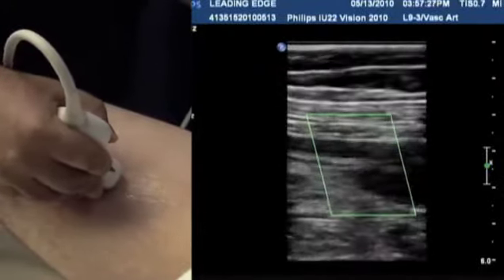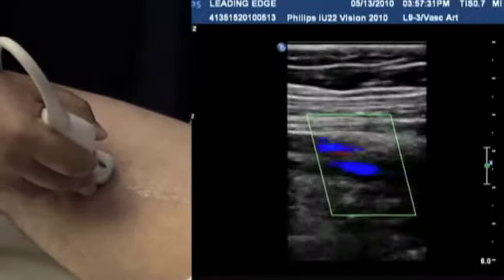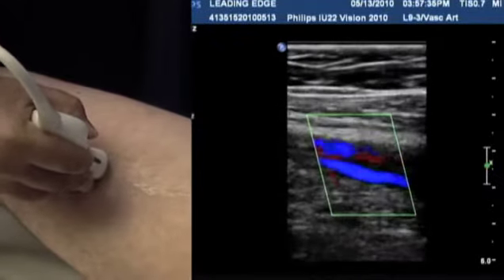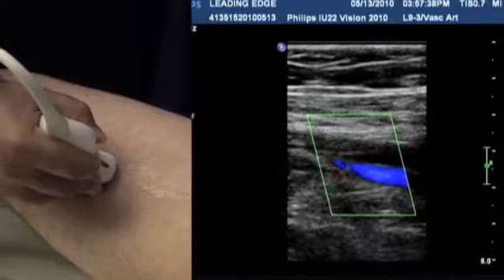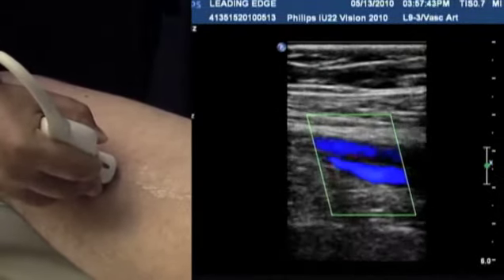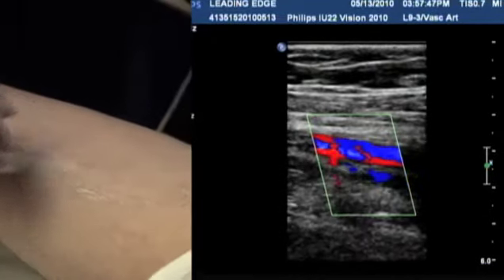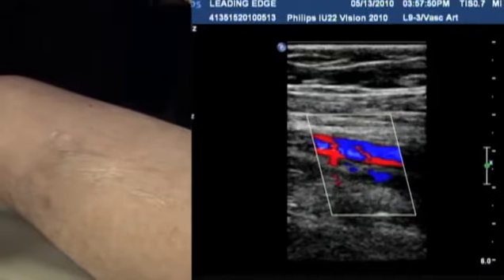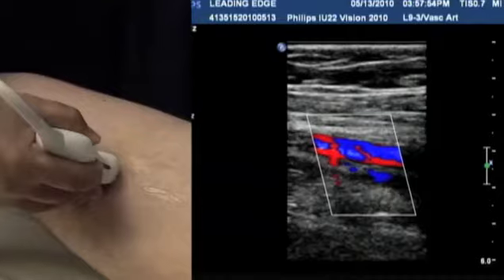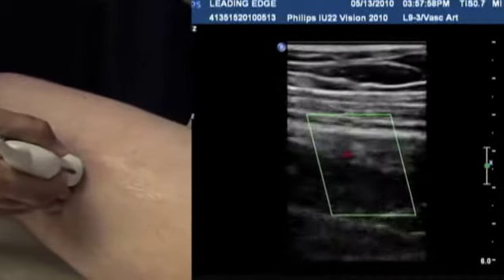As you can see on the ultrasound image here, the vessel is starting to take a dive deep into the musculature at about the distal third of the leg. This is the area where the superficial femoral artery is now referred to as the above knee popliteal artery. So what I'm going to do is just freeze that, and I'm going to show you a nice overlapping technique for evaluating this area. What I like to do is evaluate it from both the medial aspect, this is where I left off, and again, this is above knee popliteal.